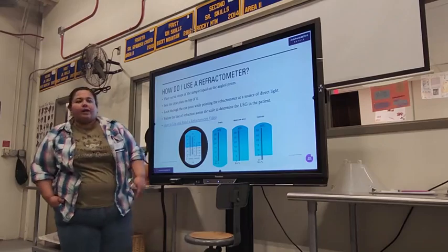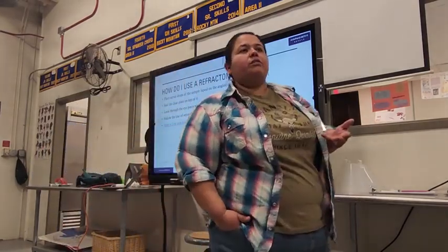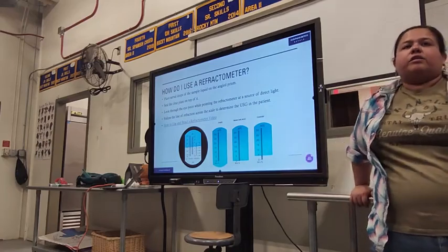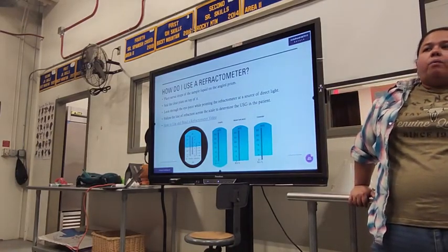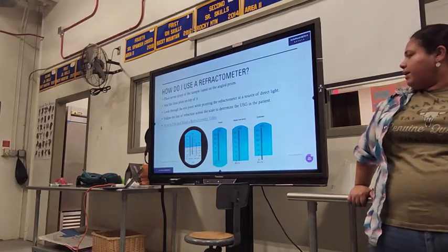When you calibrate it, meaning when you put distilled water in it to be sure everything is okay, right? It should be at that 0 line. It should set right at the 0 line. Okay? Just 1 drop of water. Okay? It should set at that 0 line.